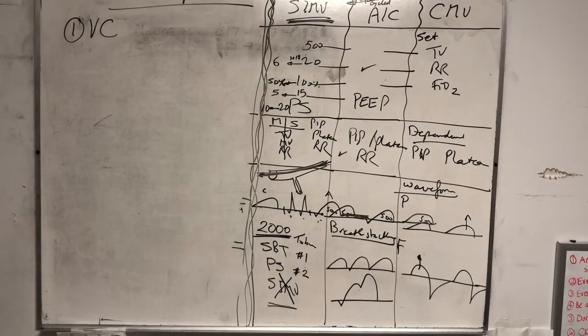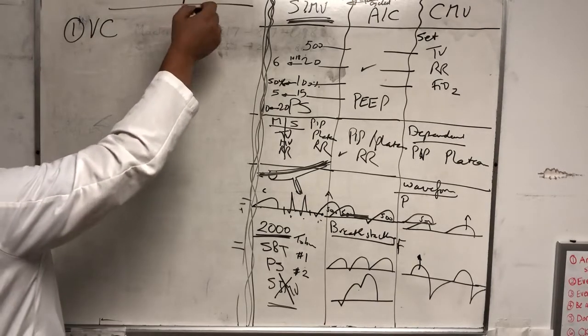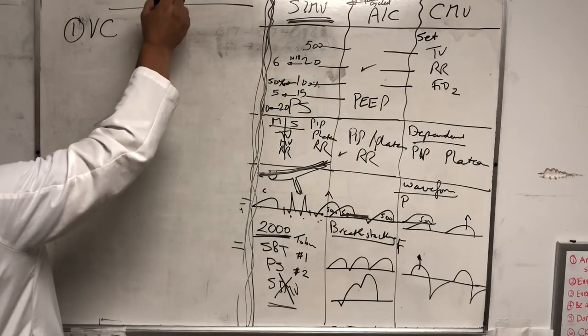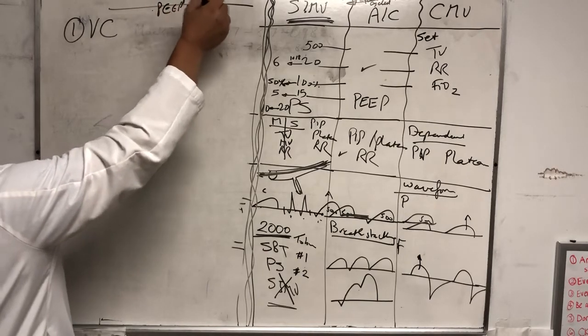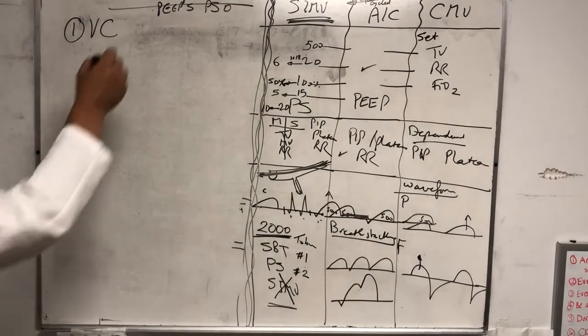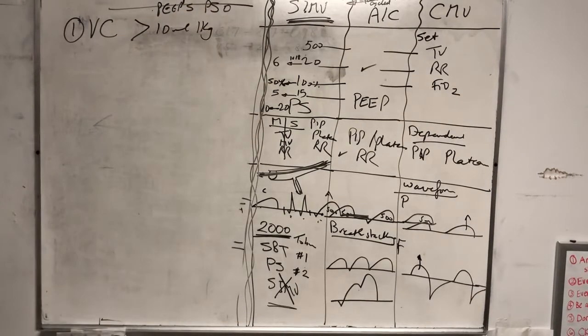It doesn't matter. Don't be nasty. Just say, okay, thank you for doing the vital capacity, but nobody's using it anymore. Don't say that. So vital capacity is basically taking the patient off the vent mode and putting him on 5 of PEEP and pressure support of 0, and telling the patient, take the deepest breath you can. Awake patient, right? And if he can take more than 10 milliliter per kilogram, he can be extubated.